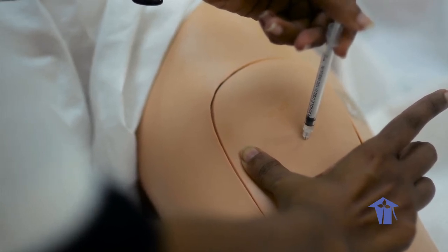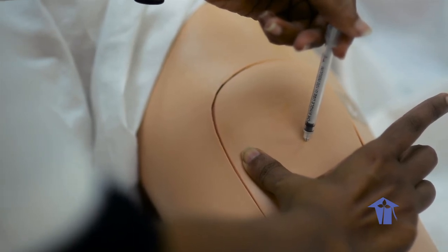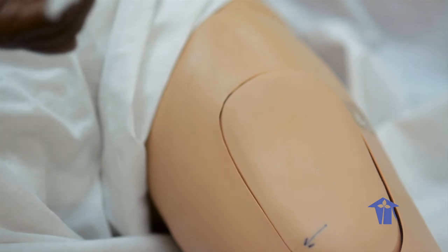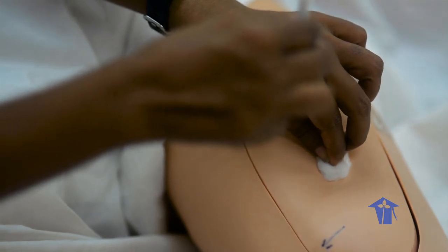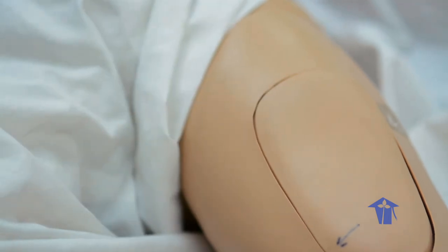Inject the medication slowly at a rate of 10 seconds per milliliter. Withdraw the needle while supporting tissue with your non-dominant hand. Use a gauze, apply gentle pressure to the site. Do not massage the site. Never recap needles. Place needle in the appropriate receptacle.